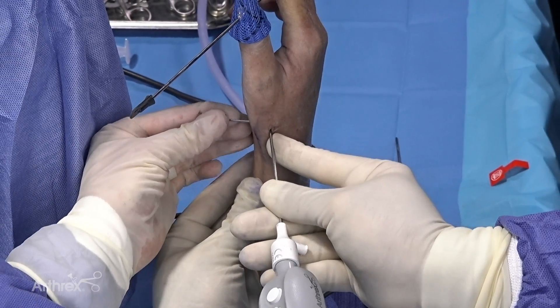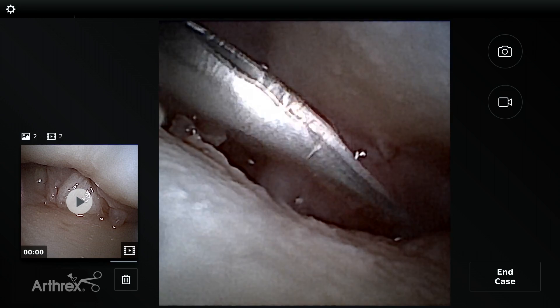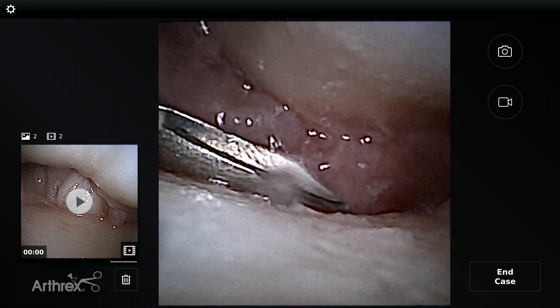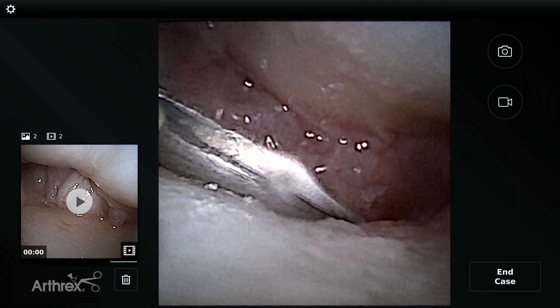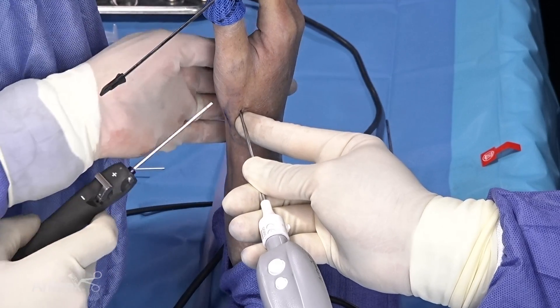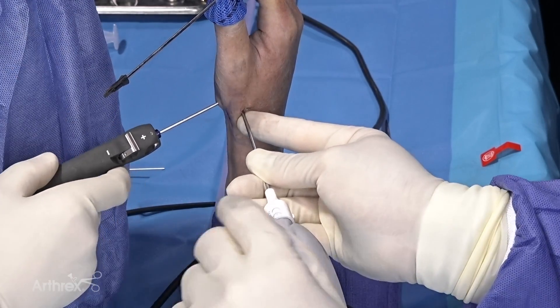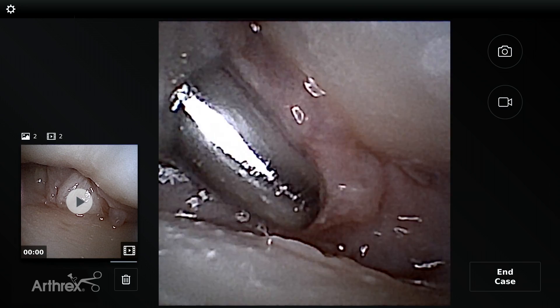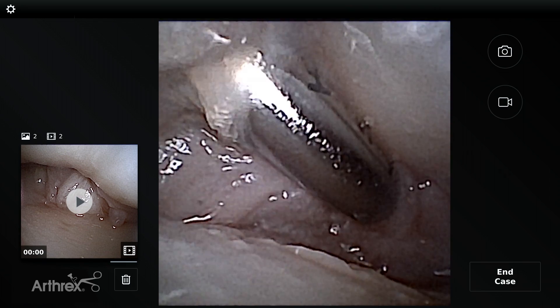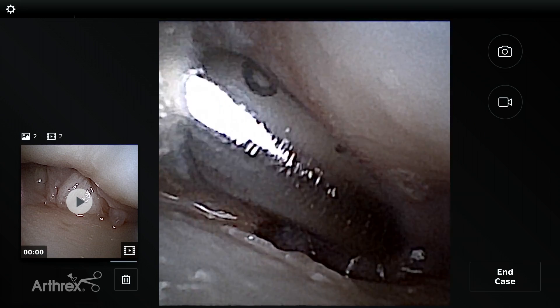Coming in either through the 1R or the transthenar portal, we can debride the synovitis in the joint. We're actually going to be working through the transthenar portal — it gives us a bit more working length so the instruments aren't abutting each other and we're not sword-fighting in the joint. Here we have a nice space; this is an 18-gauge needle, and we're going to put our two-millimeter arthroscopic shaver through this portal to debride the synovitis.